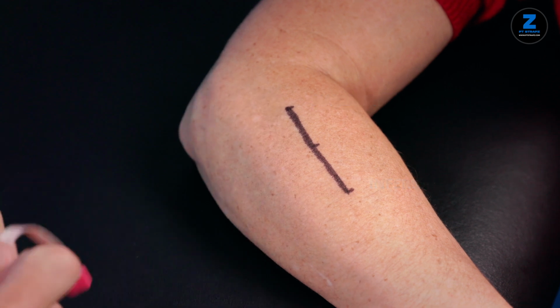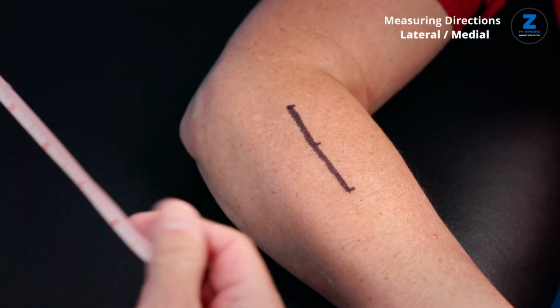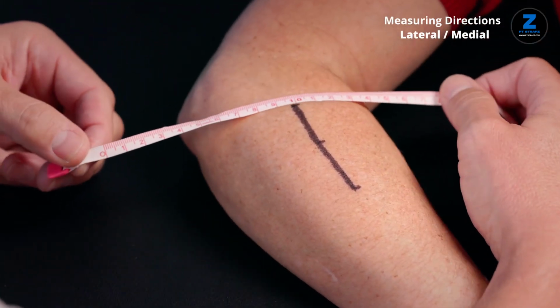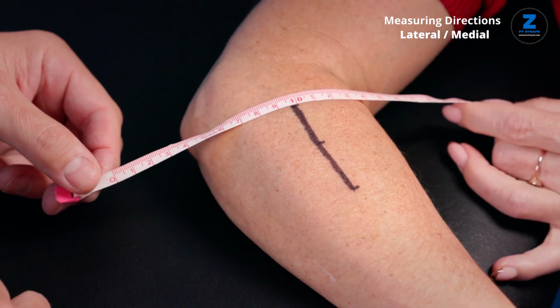I'm going to measure 5 different directions: inferior, superior, medial, lateral excursion, and then the lift. Okay, so I would use my tape measure. I'm going to put the tape measure, I'm going to use 10 as the focus. There we go.